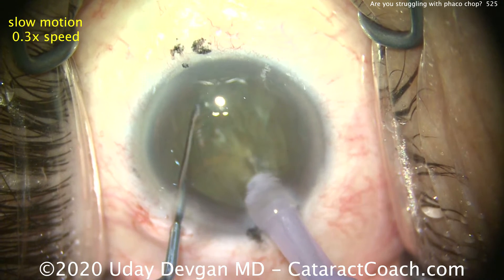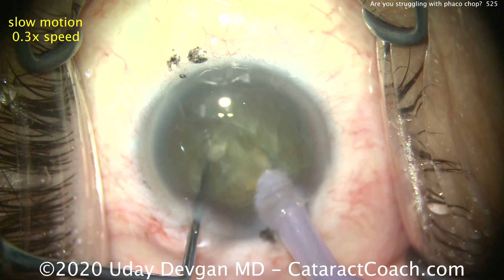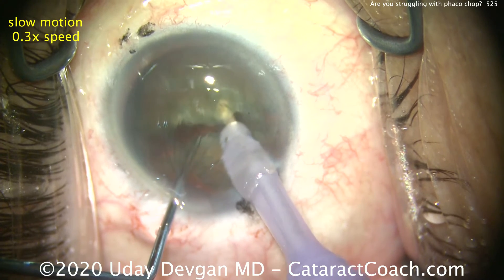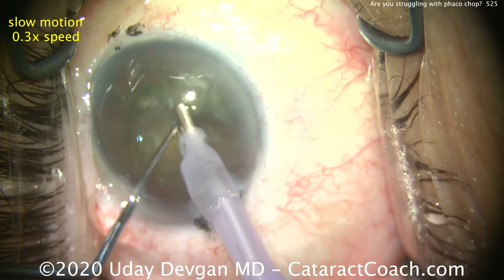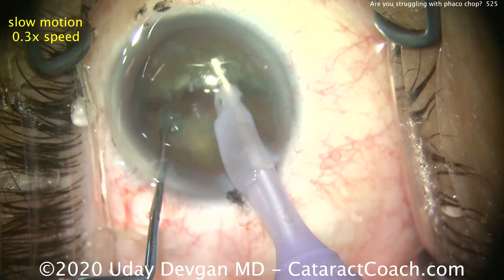Notice the FACO probe's already buzzed in all the way to the silicone sleeve. The chopper tip's fully embedded. Instruments come together and then are pushed apart. Now let's really push the two halves apart to propagate that chop so we have a complete split into two hemi nuclear halves.